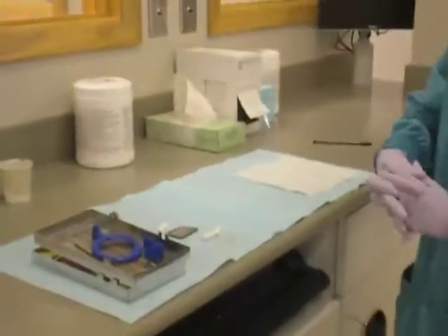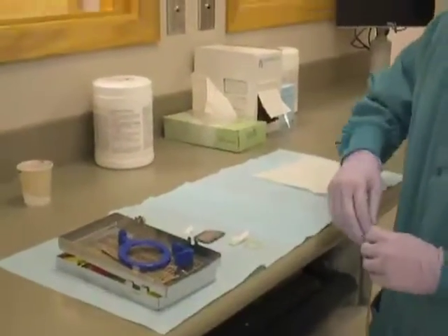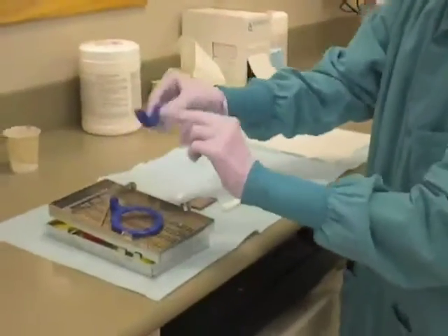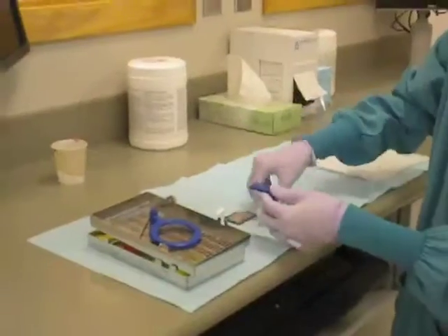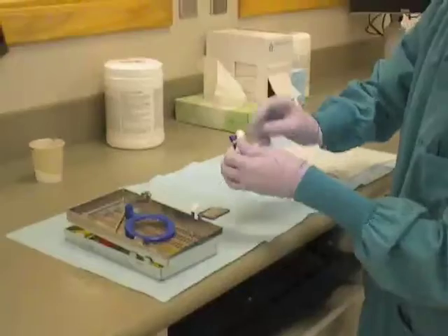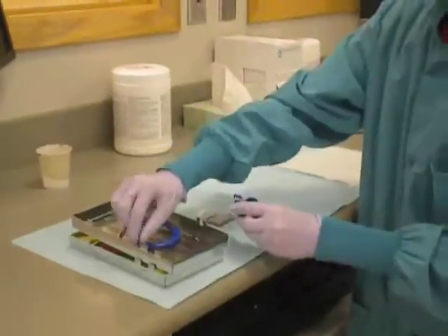Instrument Setup. In order to take a maxillary canine periapical radiograph, begin assembling the anterior XCP instrument. Begin by taking the anterior bite block, usually blue, and attach a cotton roll with a rubber band to it. Then attach the bite block to the XCP rod.